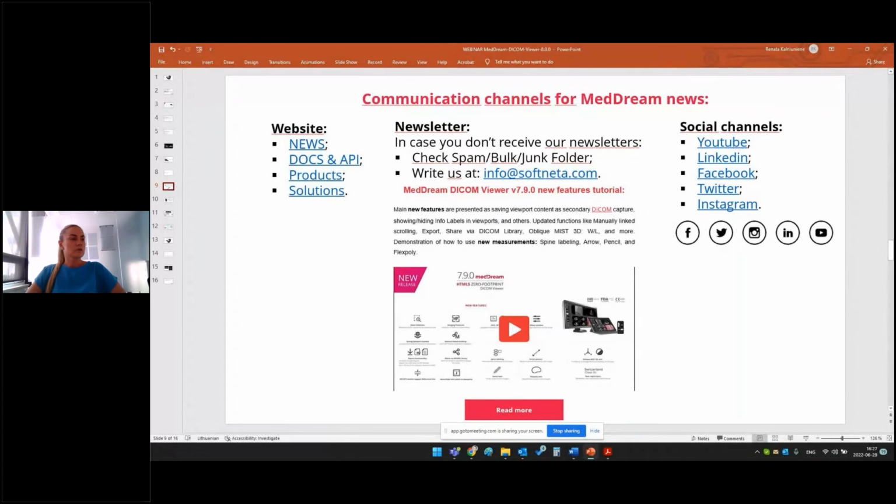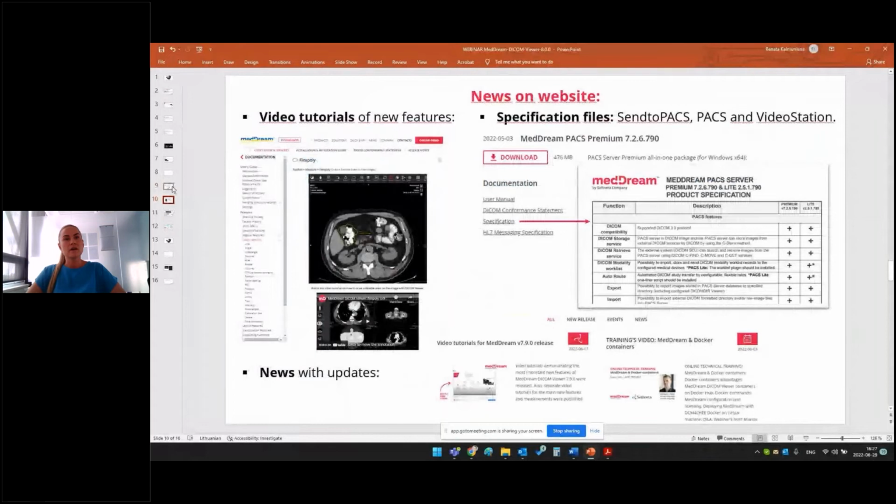Okay, so I will go to our website. As I mentioned before, we are preparing video tutorials for new features and new release presentations, and all these video tutorials go to our news page or to the documentation page.